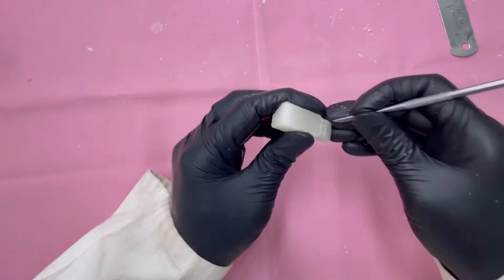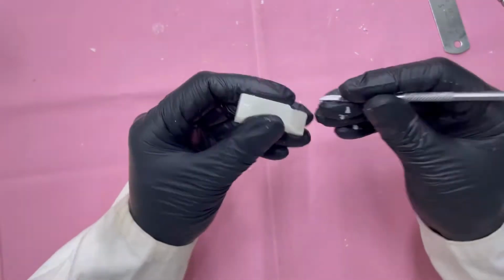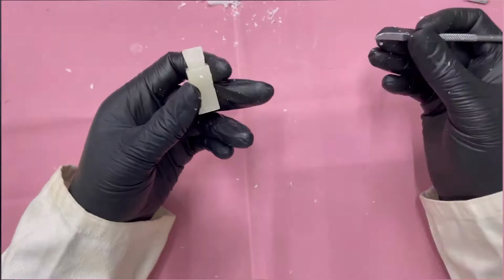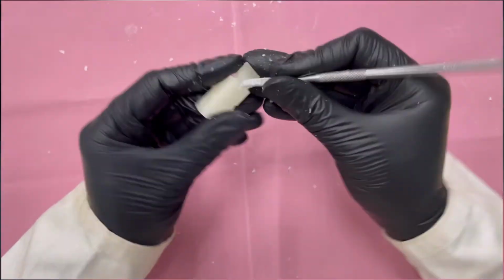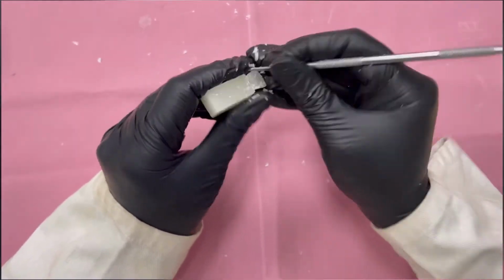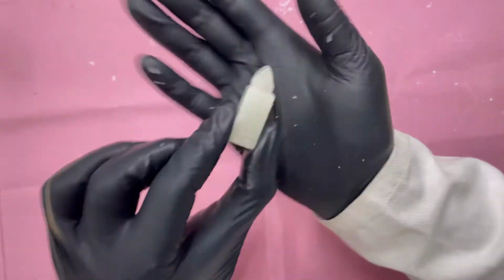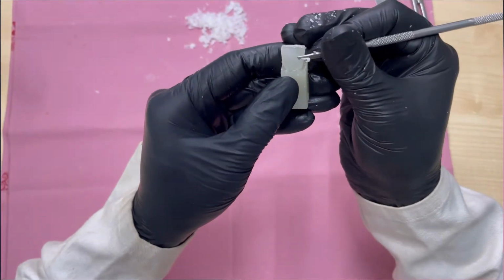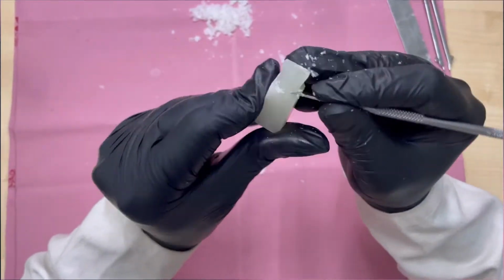Now we will give cervical convergence. Now we will try to obtain the crest of curvature on the cervical 1/3 labial. We have a desired outline with the crest of curvature. As we know, the central incisor is tapered lingually, so we will remove the wax on both sides to obtain the tapering.